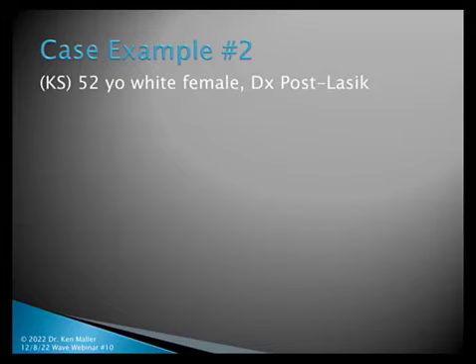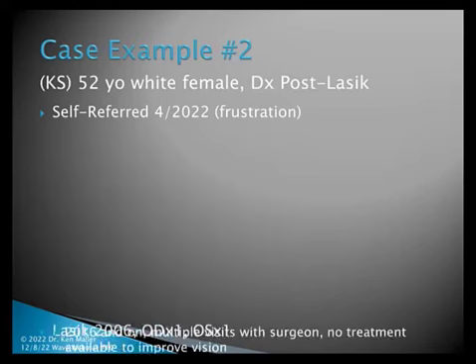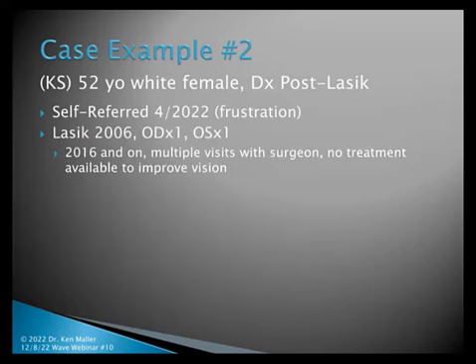KS is a 52-year-old white female, and she's post-LASIK. She self-referred in April of 2022 out of pure frustration. She had had LASIK in 2006, one procedure in each eye. And for 10 years, she was actually very happy with her results.